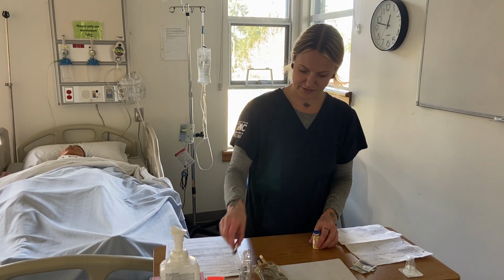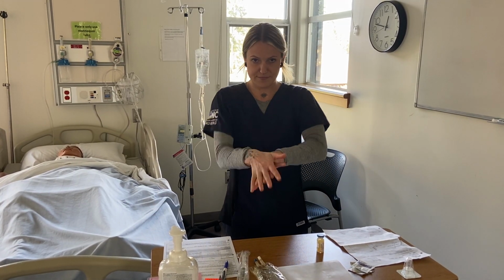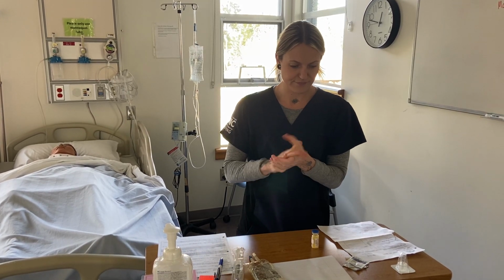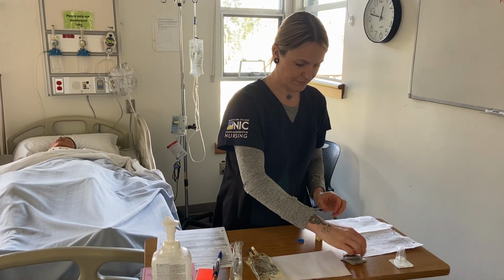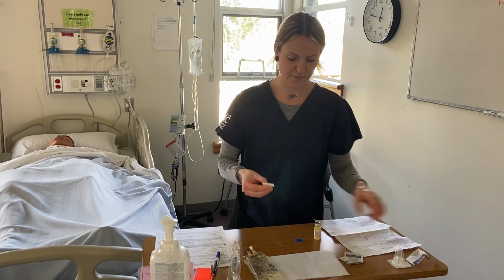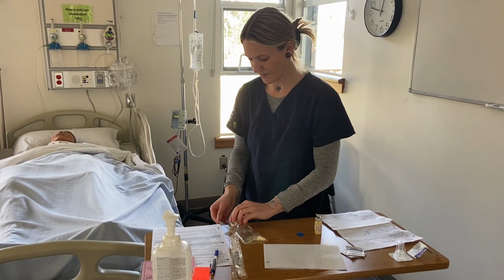So I will perform hand hygiene first. All right. Alcohol swab at the top and do the mini bag as well.